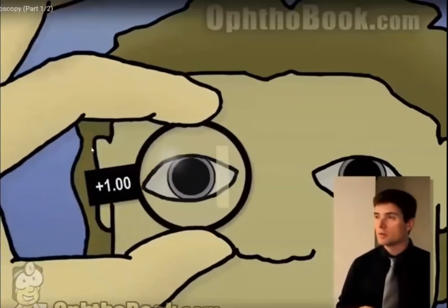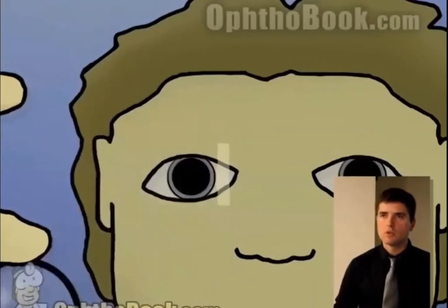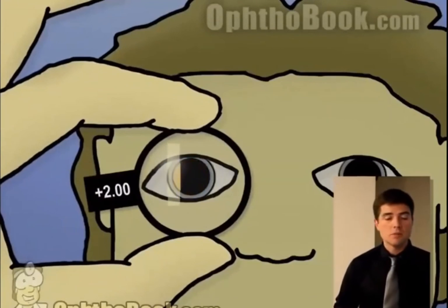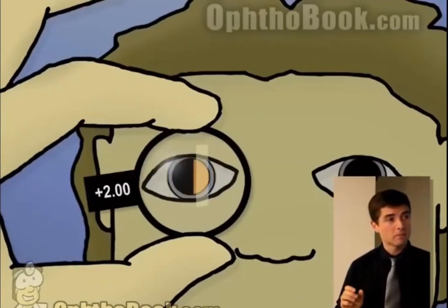And what he's doing is that he's trying to correct it with some plus lens, and there's still some hyperopia, as you can see here, because it's moving together with the light. But you can see some improvement because the light beam is a little bit wider, and now he's correcting it even more, and it gets wider again. So there's some correction happening, but not sufficient to fully correct it.